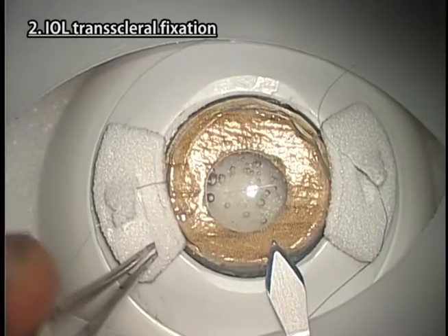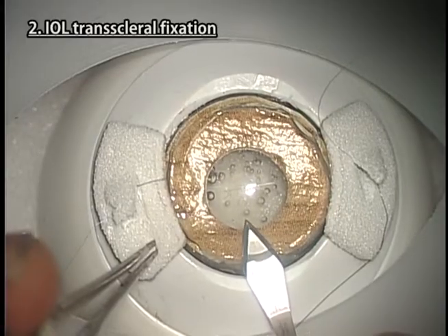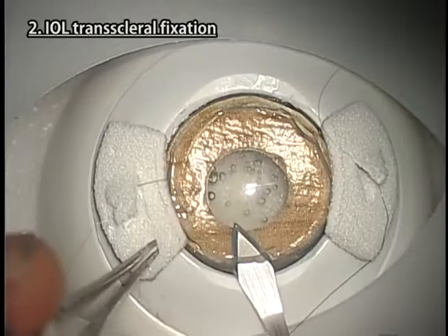Make a one or two-plane corneal incision. An incision slightly larger than in human eyes is necessary because Kitaro's cornea is slightly harder than human eyes.